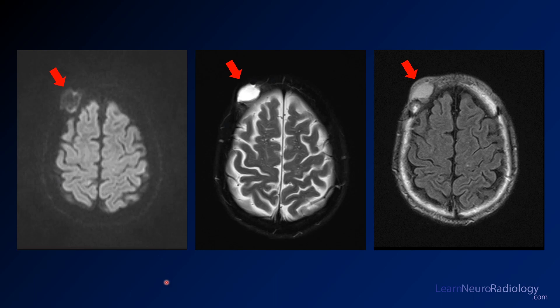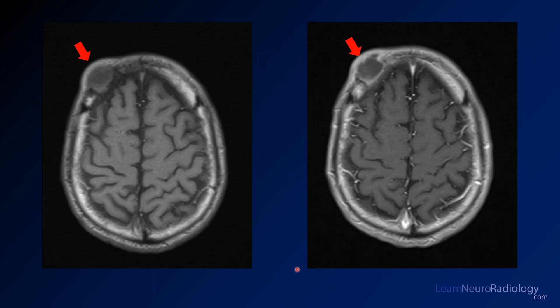Here are the images from the first page. On diffusion it's a little bit abnormal but not greatly so, mostly around the margins. On T2 it's very bright centrally, and on FLAIR it just doesn't suppress like CSF. On the pre and post contrast you'll see that lesion where the normal cortex of the bone is gone, and you see enhancement around the periphery of this lesion. So you have an expansile, peripherally enhancing mass in the calvarium — a concerning lesion.